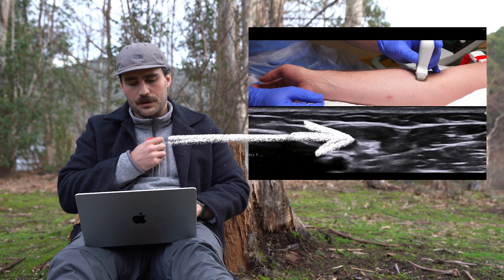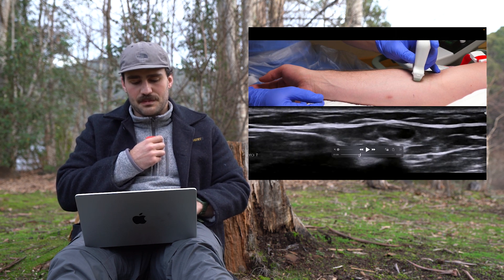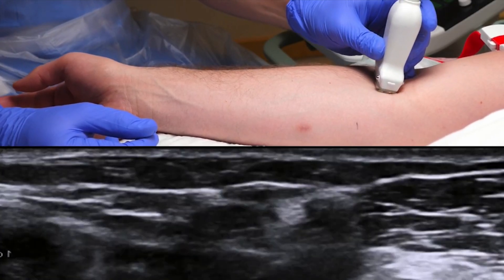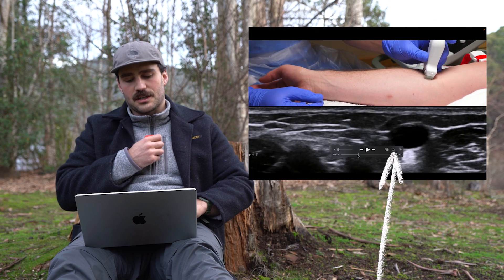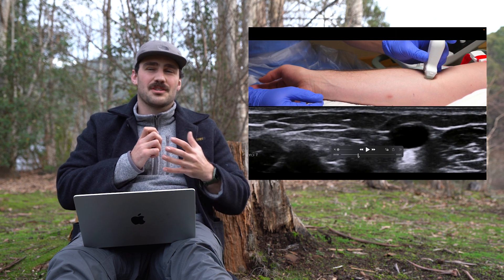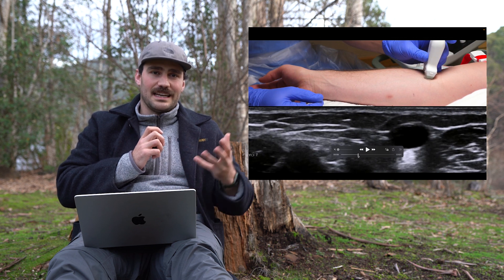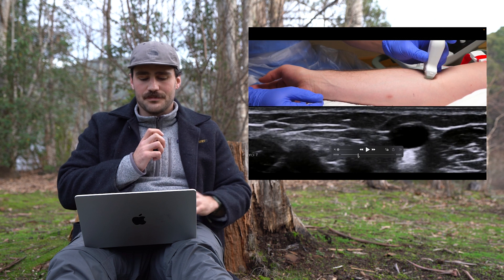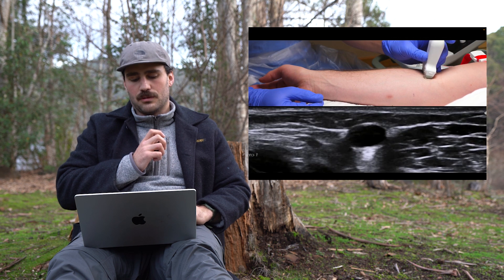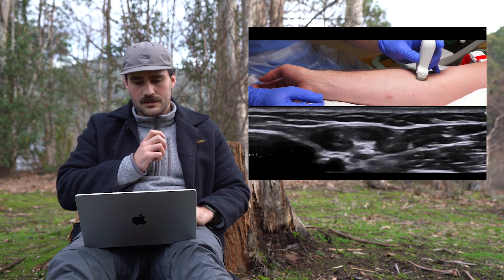This is really important: when you push a vein down like that and it bounces back — when you compress it and that circle gets compressed — that is a really good sign that it's a vein, not an artery. That's the main thing we're trying to confirm: we want to put the cannula inside the vein, not the artery or anywhere else. So one thing I look for is: is it compressible?